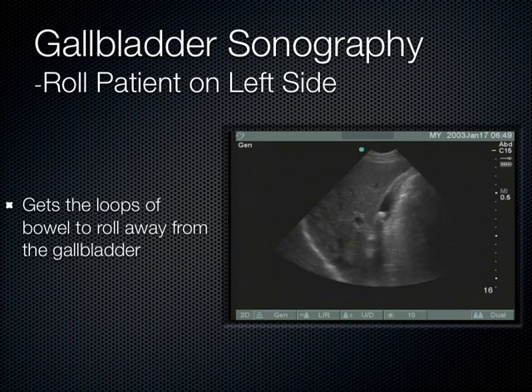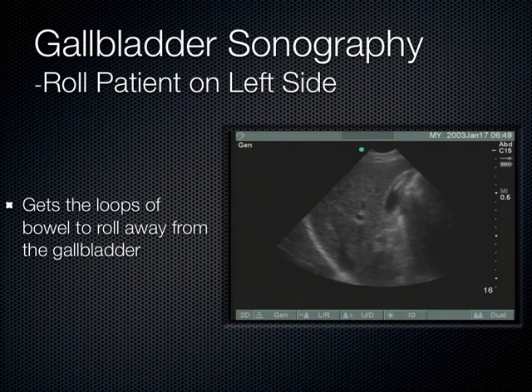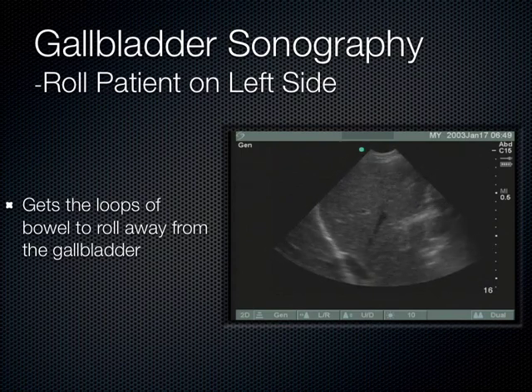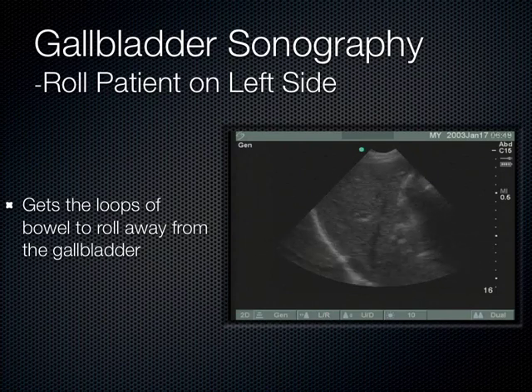Now, what you're going to hear next is a prior ultrasound fellow of mine named Will Scruggs, and he's made it his life's work with ultrasound the gallbladder. So I captured a video of him showing the technique he uses to scan the gallbladder. Now, he's got a really funny voice. I just want to warn you, okay? That's actually how he talks.